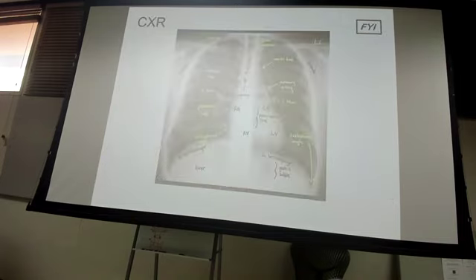So this is actually a pretty good picture to save for your records later on. The only way you're going to get better at x-rays is by looking them up, right? If you have a nice radiologist, what do they do for you? They give you a positive arrow sign. The good radiologist will point to where the nodule is, and they'll put a little arrow on there.